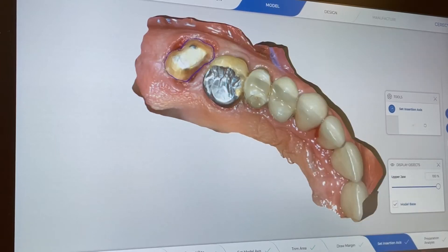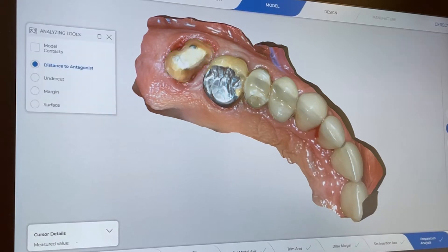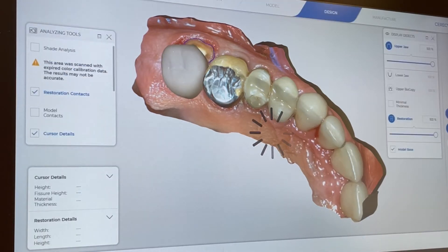Here we're checking the margin. The proposed margin was quite good. We can fine-tune it if necessary. Now we're getting the reduction guide and we go ahead and move forward — it gives us the proposed crown.